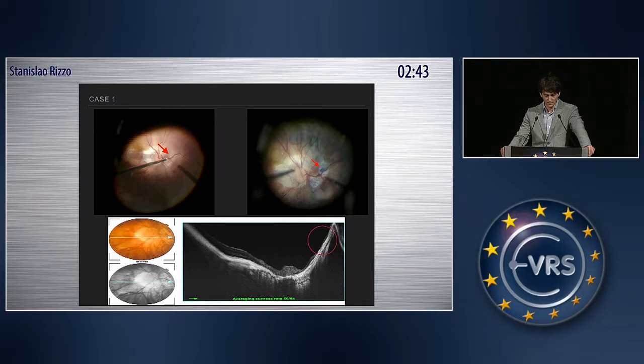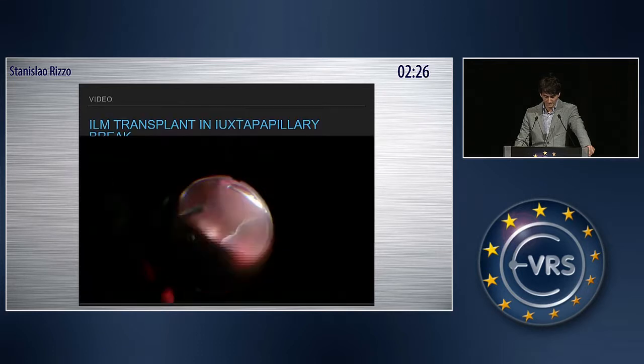You can see the image on the left during the surgery, and the image on the right under silicone oil after the surgery, when you see the blue ILM plugs, and then the OCT images after the silicone oil removal.